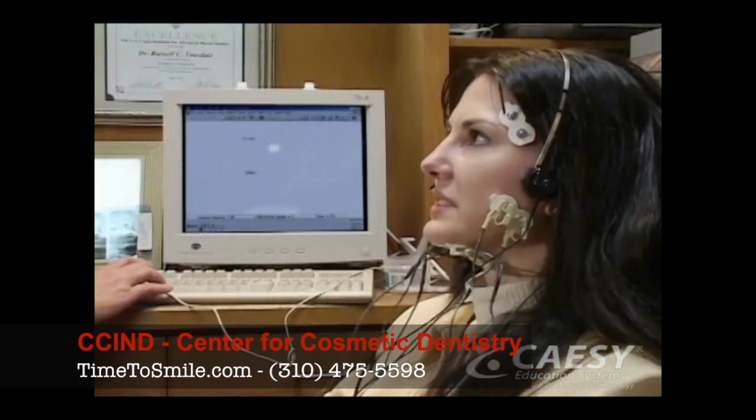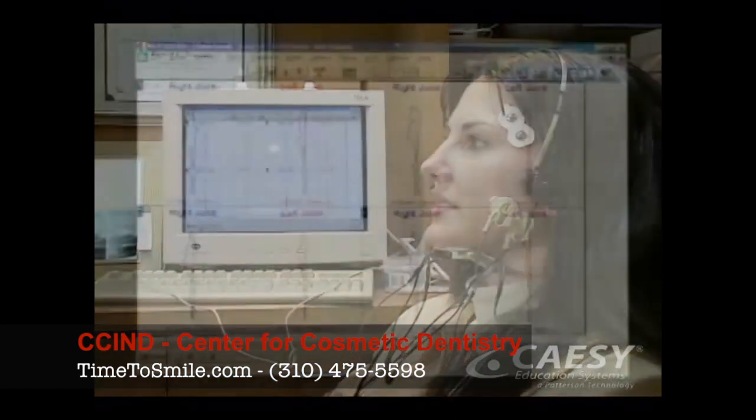The sonograph, or joint vibration analysis equipment, measures the sounds in your jaw joint as you open and close your mouth. These measurements can help us identify joint problems.